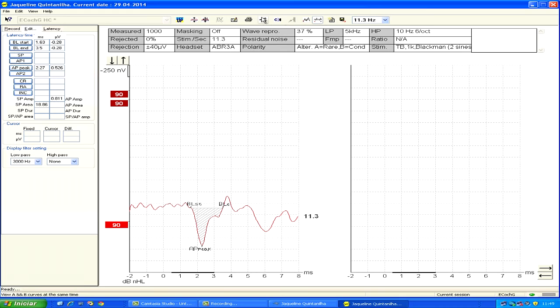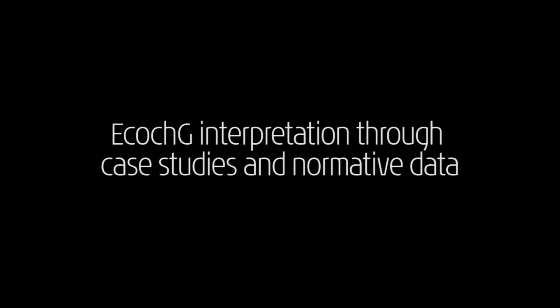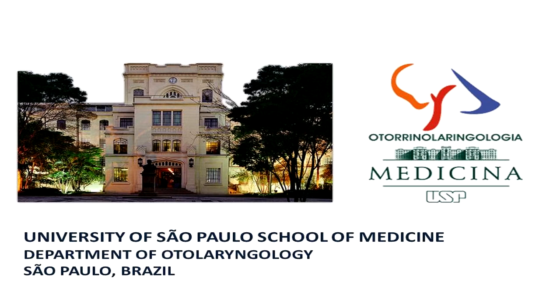Now we will analyze condensation and rarefaction curves separately. Here you see the cochlear microphonics. We do about 200 electrocochleographies per year at our clinic. Now we will show you some of our previously collected waveforms.